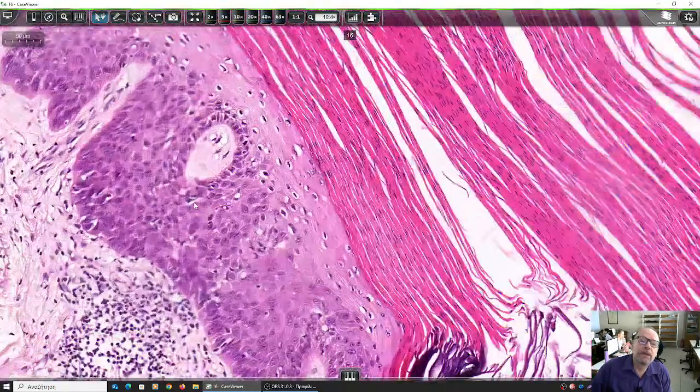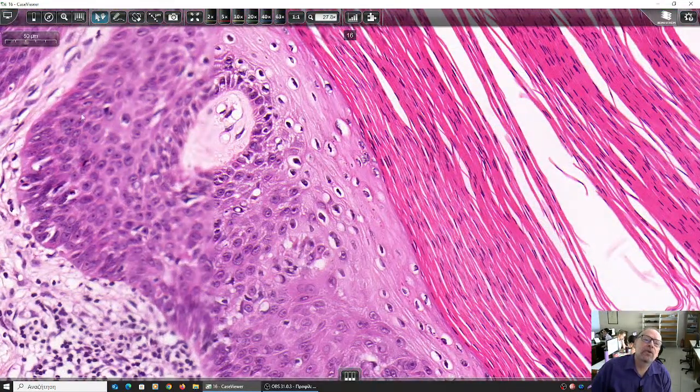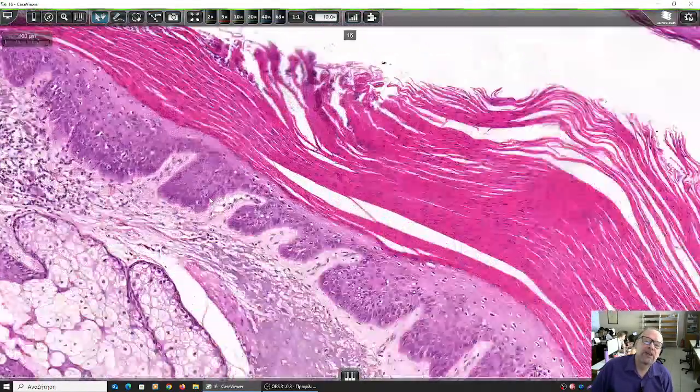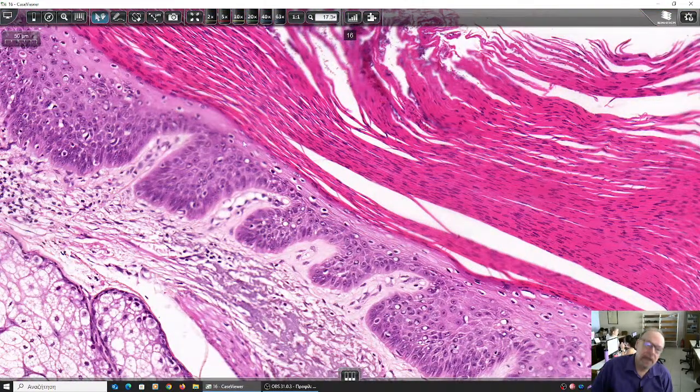So have a look here, you see they have some nucleoli, they have some atypical features, some loss of orientation, while the squamous cells which remain here are growing parallel along these lines. However, these cells occupy an increased part. See how many they are? Too many. And you see how the keratin cells are few. So this might be a sign of a population of cells with a malignant potential, which, however, is not cancer.